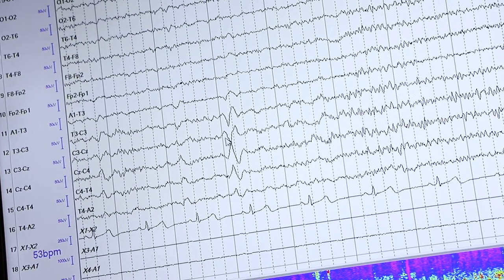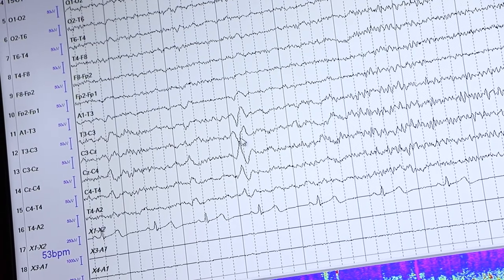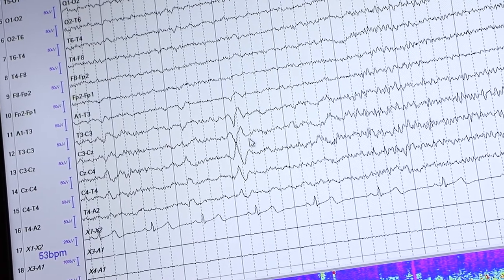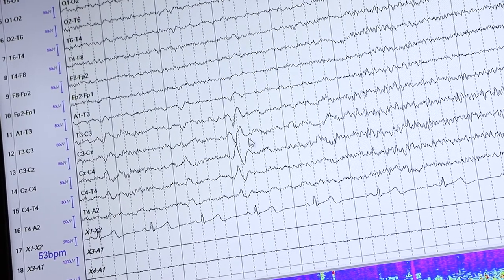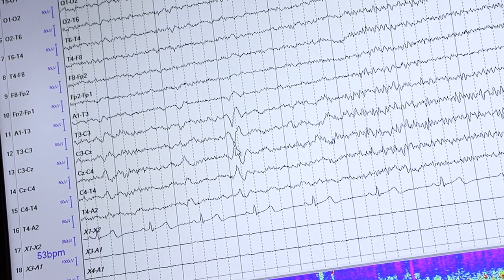You can see they are phase reversing, and that tells me that's a vertex wave. That tells me the patient is in Stage 1 of sleep.